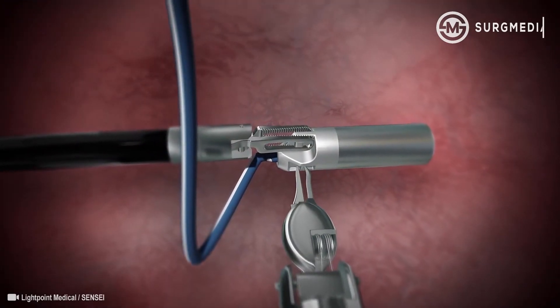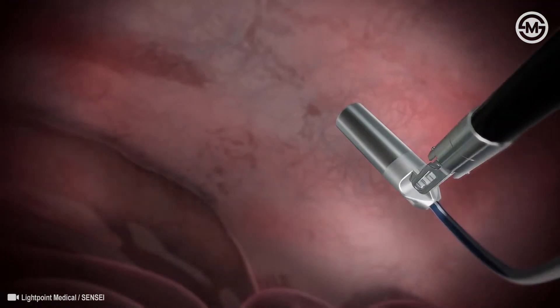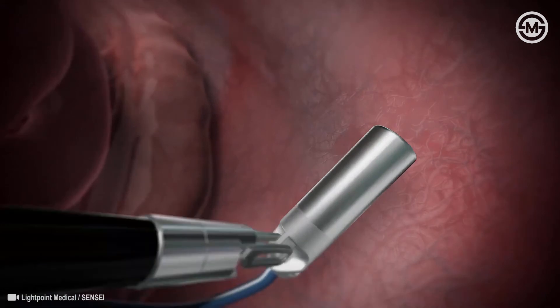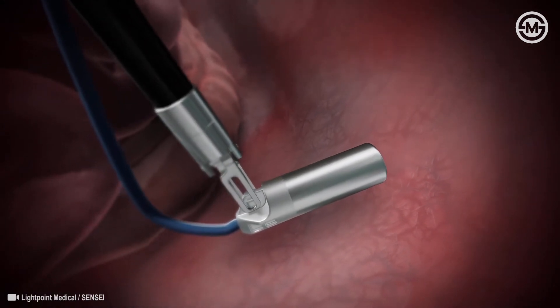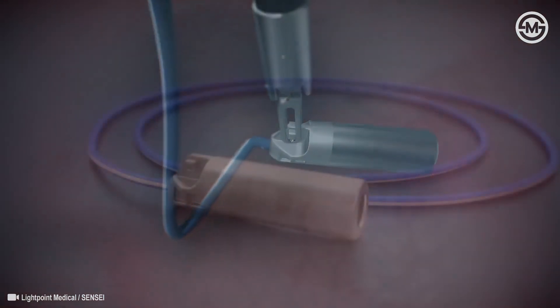Sensei is designed to be used with tissue graspers, offering multi-grip orientations for maximum agility and unprecedented access. The probe's side pockets provide a safe location for needle drivers to grip and reorient the device quickly.